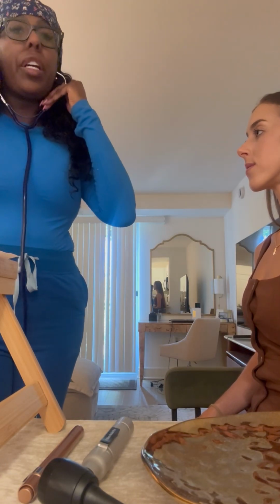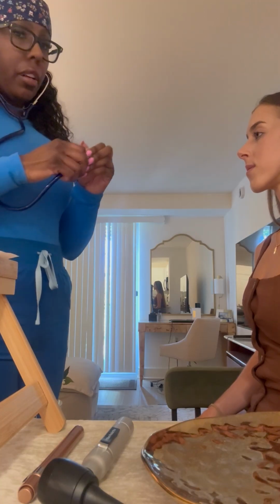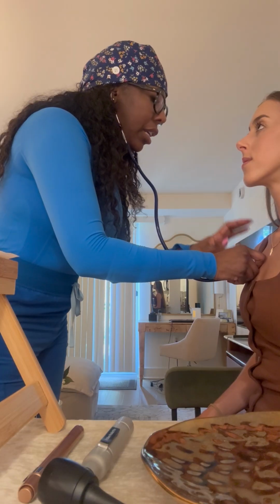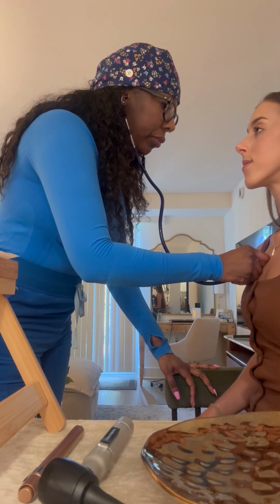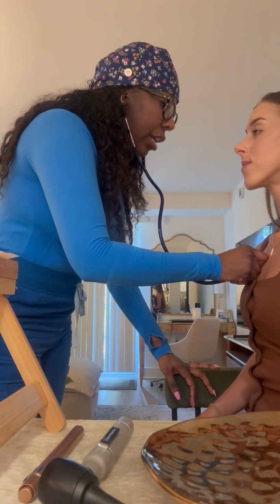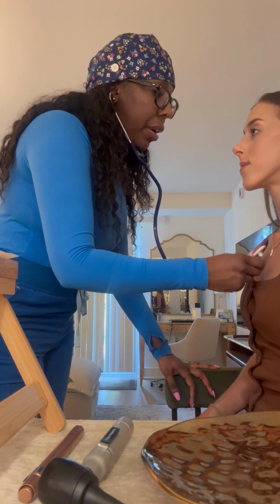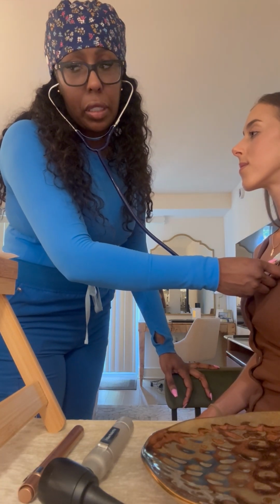I'm going to start with the aortic valve, and I'm going to use the bell of my stethoscope. The aortic is noted at the 2nd right intercostal space. S1, S2 lub-dub noted. Now we're going to move on to the pulmonic valve, which is the 2nd left intercostal space.